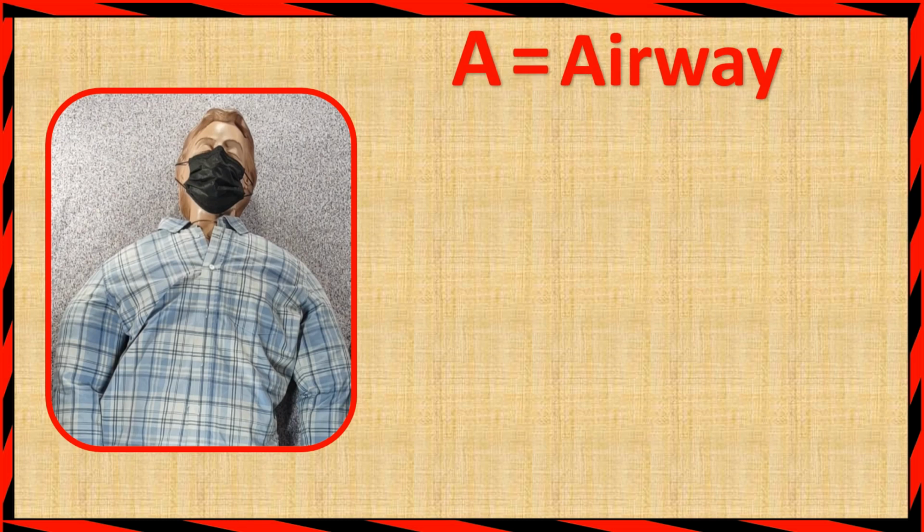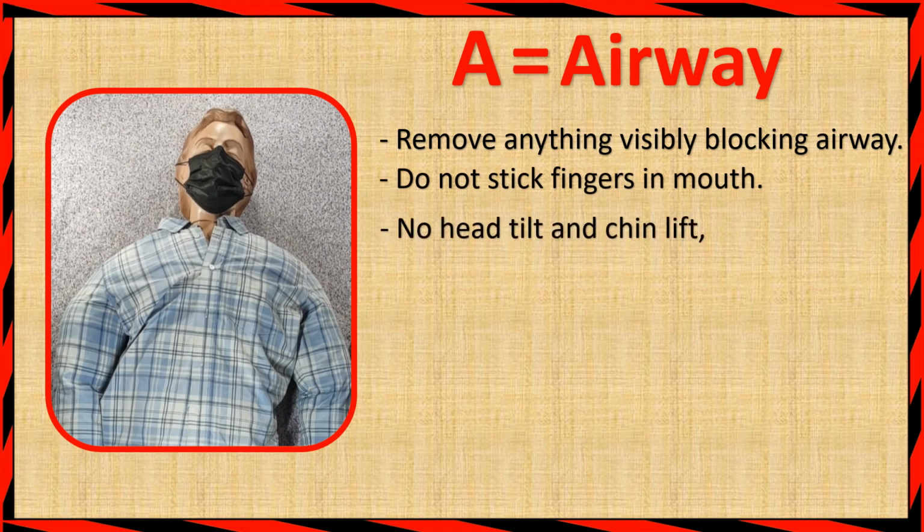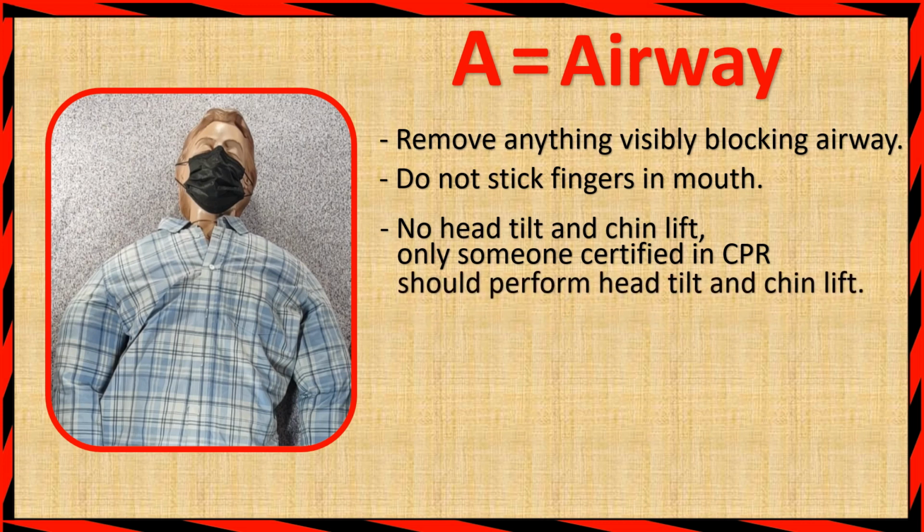A for airway. Remove anything visibly blocking the airway. Do not stick fingers in the mouth. No head tilt and chin lift. Only someone certified in CPR should perform head tilt and chin lift.